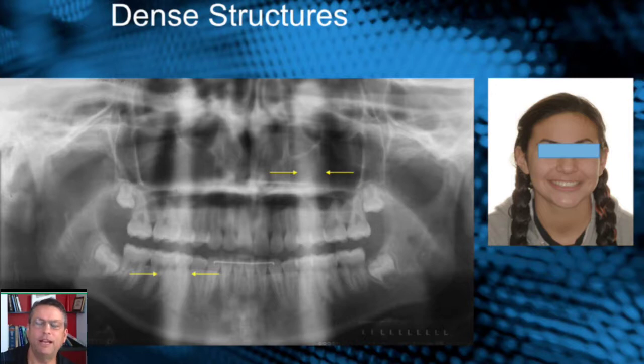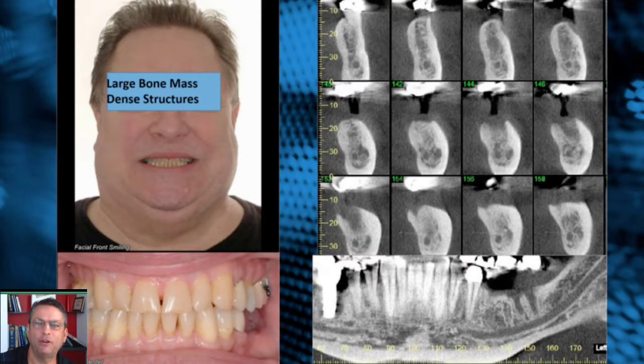So you might have done an excellent quality scan on a patient that happens to have large bone mass and large tissue mass. The patient didn't move, but the scan is noisy. And the scan is noisy due to the limitations of what we have to work with in our CT scanners.